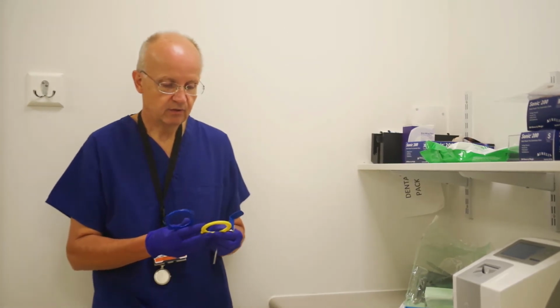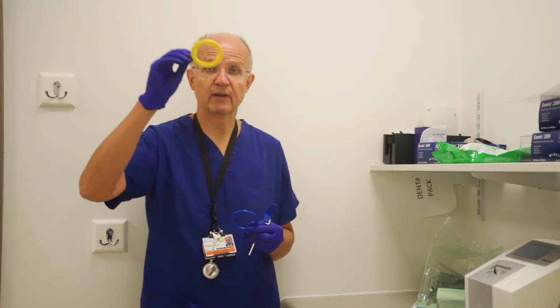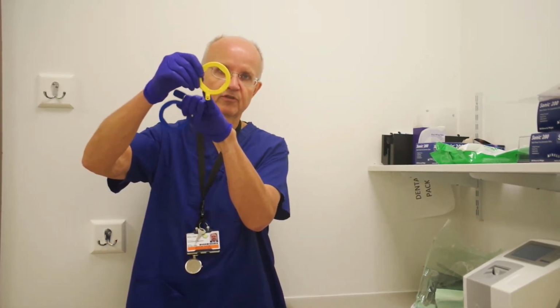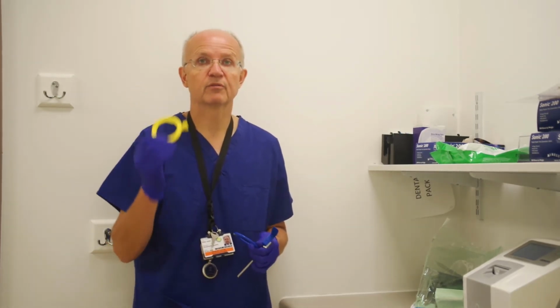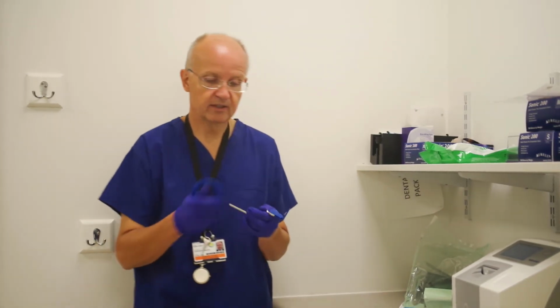like that. Okay, so you remember when we looked at the posterior, it was quite important to get the ring around the right way. And that's because, if you can see here, the little bracket at the bottom is offset to one side. So we have to think whether we're doing an upper or lower and put it on so that we can see the bite guide right in the middle.